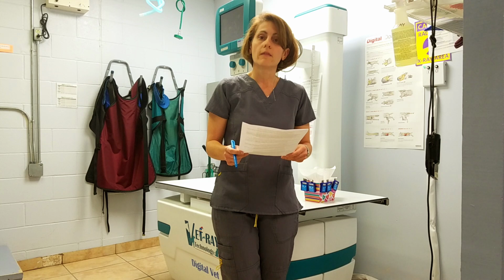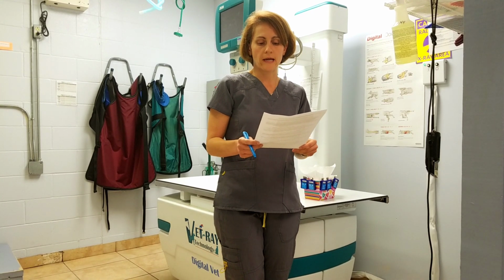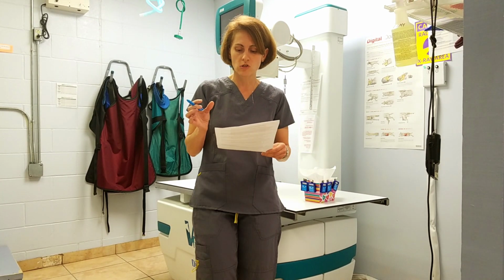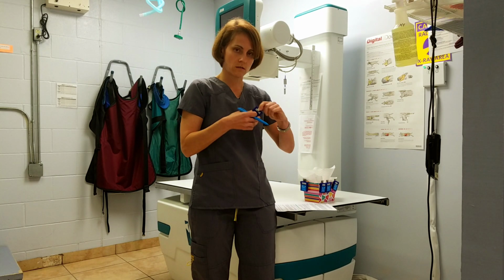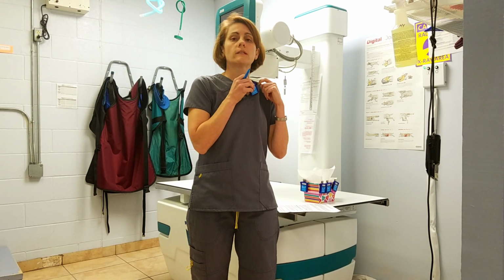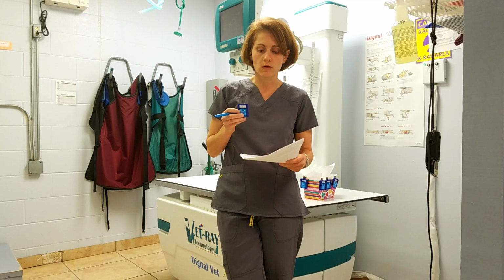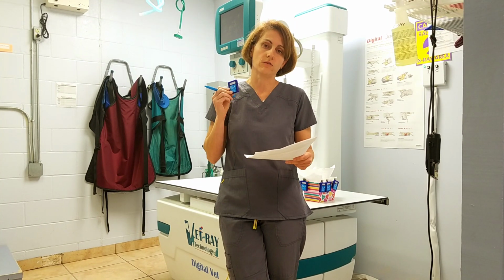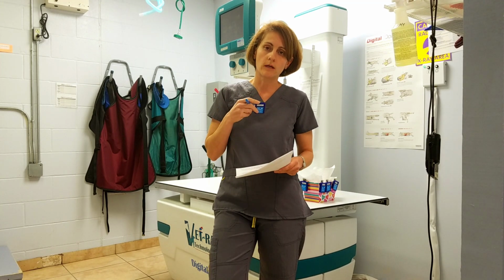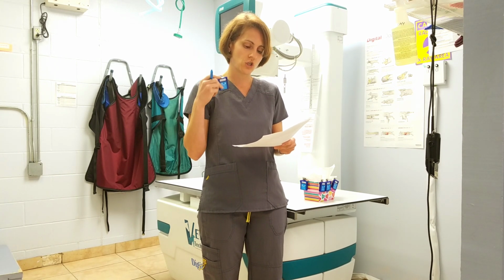Under number 1, there are individual monitoring requirements. Any adult who's likely to receive any type of exposure here at our practice will have their own individual monitoring badge. This is what a badge looks like. These badges should be worn in an unshielded location. If you're doing any type of x-rays, you should be wearing a shield. The badge needs to go on the outside of your shield. We don't want to know what you're being exposed to inside the shield. We want to know worst case scenario, if you had no protection at all, what you're being exposed to. So always wear it on the outside of the shield, typically up at the neck.